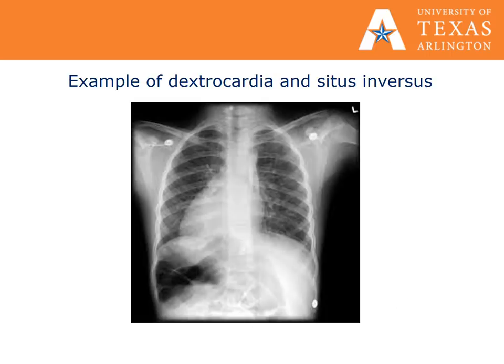This is an example of dextrocardia. The heart is reversed and is positioned on the right side of the chest. This particular patient also has situs inversus of the abdomen because their stomach bubble is on the right side and the liver is on the left.